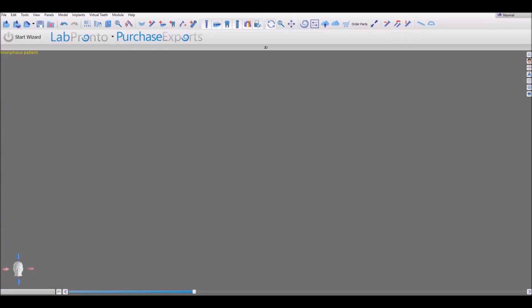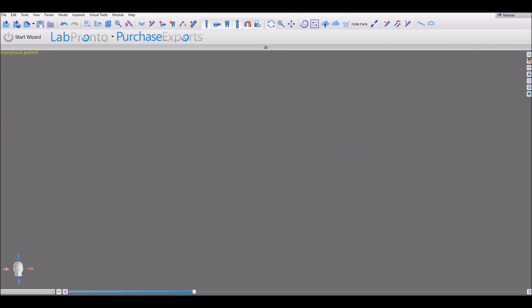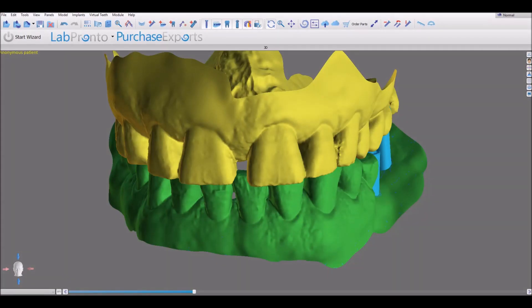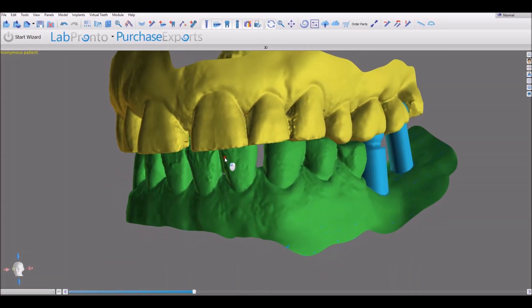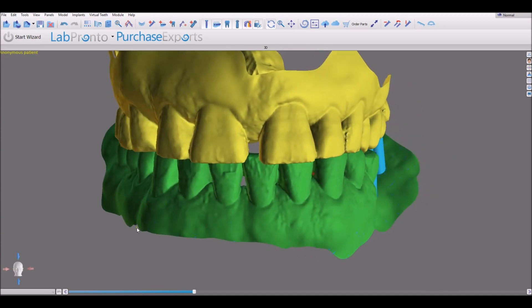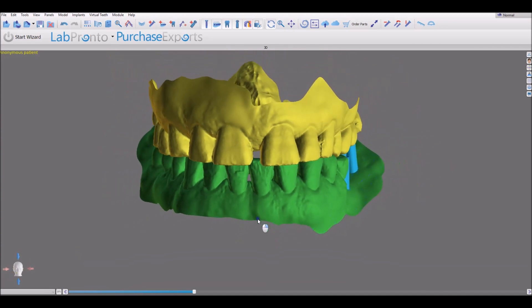We're going to take a look at the new crown functionality in BlueSkyPlan. I'm going to drag in the surfaces. You can see we're currently in normal mode of the software. The first thing we want to confirm is that the models have the same general orientation as the head on the bottom left of the screen.